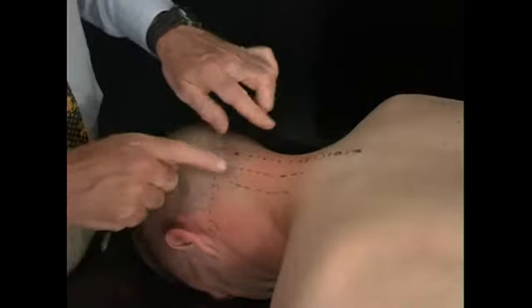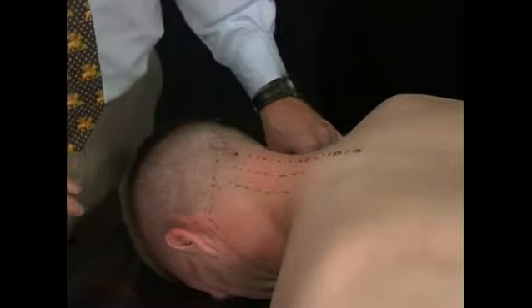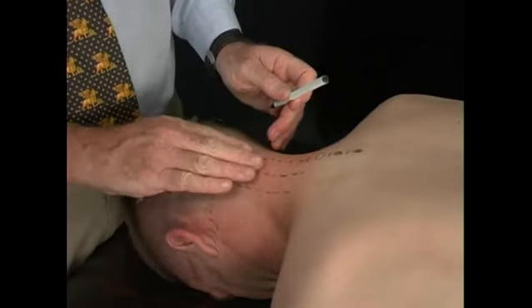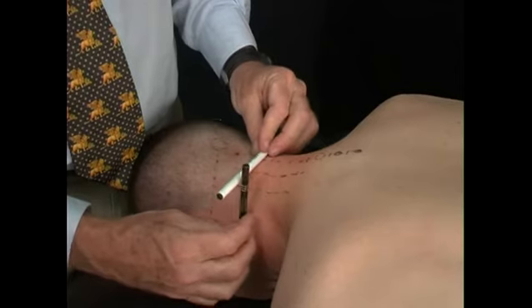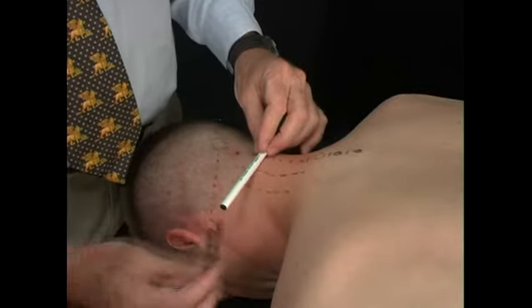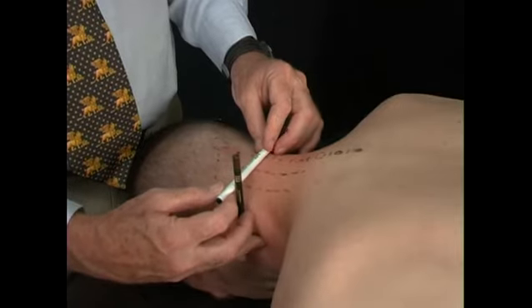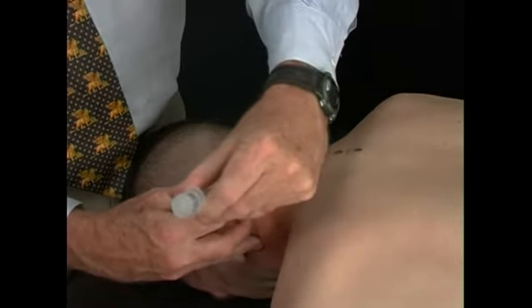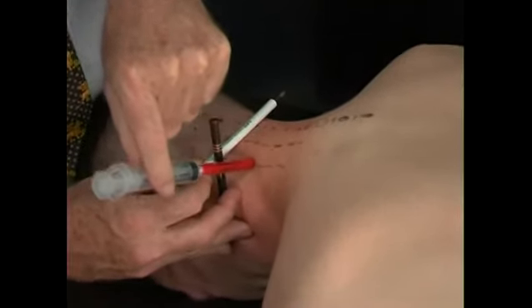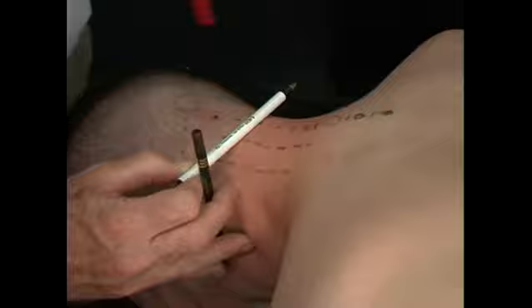So we're about 2 inches out from the midline spinous processes. Another way to look at the facet line is where the neck really turns. And in addition to that, we can place 2 right angles, 2 markers over this area so that we have 90 degrees, making a 90-degree angle here. And if we bisect that angle, coming directly down in between, directly down there, bisecting that 90-degree angle with a 45-degree angle, that's our angle to hit the facets out in this area.